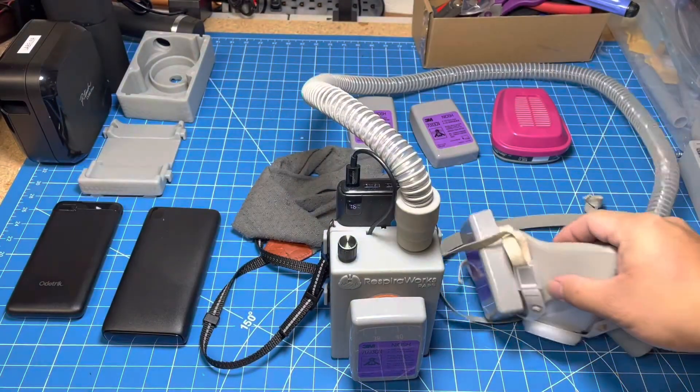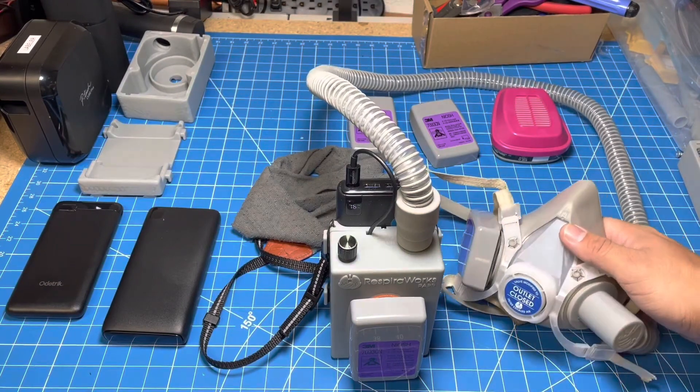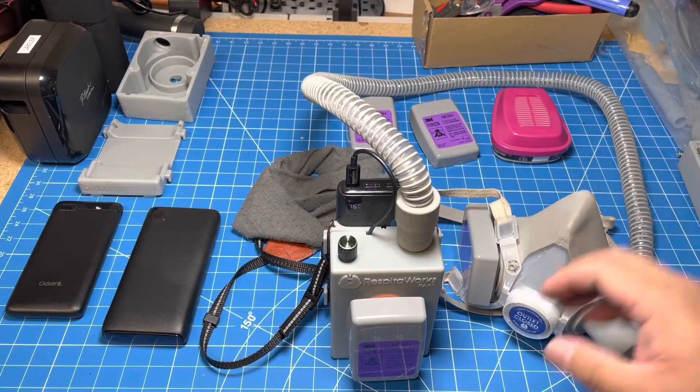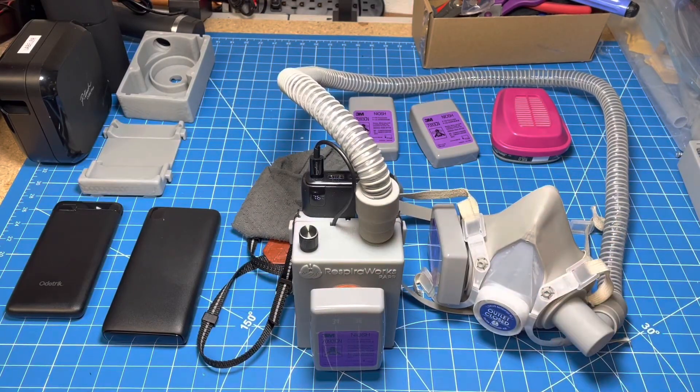It plugs into the power bank just like this, and there's a throttle control here so it can be adjusted for comfort. This is serial number one — this is my own personal PAPR, and this is what I've been wearing for the last three months. Just like the ventilator, this is a completely open-source project, so all of the designs, plans, and instructions for assembly are available on our GitHub. You can jump down to the description for the link, or just search for RespeerWorks in your favorite web browser and you will find us.